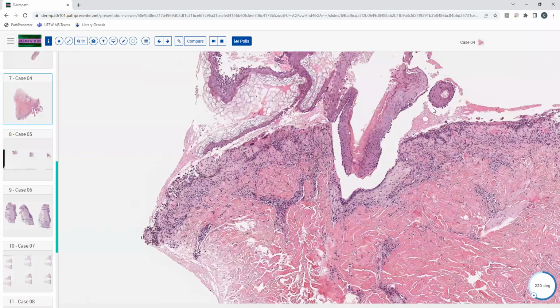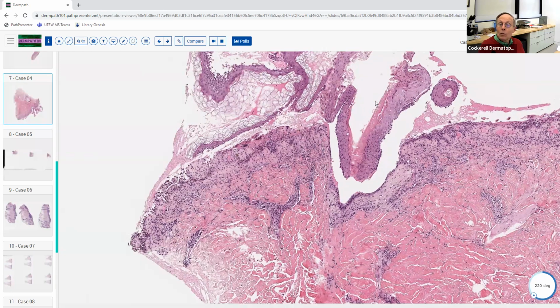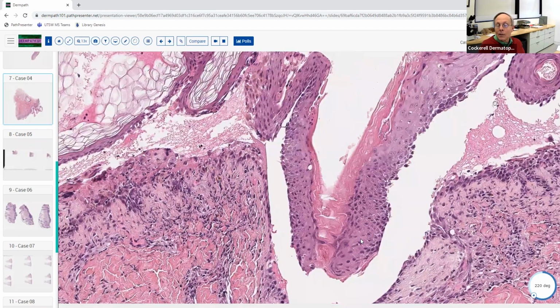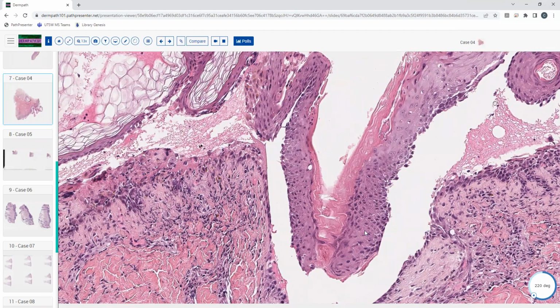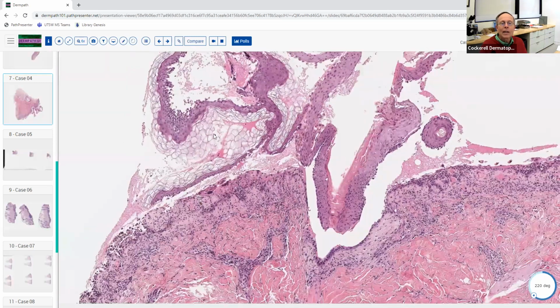And that's really helpful with pemphigus vulgaris, for example, and superficial pemphigus also, because it tracks down follicles like this. So this is really helpful if you see that. Also notice this part over here. There's nothing in the top of that follicle. That's totally normal, except maybe the very base of it right here. So you don't have a dilapidated brick wall here. You have normal epithelium, a nice clean split right at the suprabasilar area, and then no dyskeratosis, nothing. So be careful of trying to find a diagnostic area that can help you.